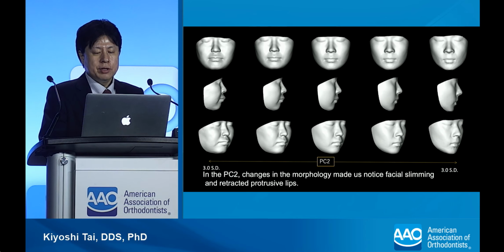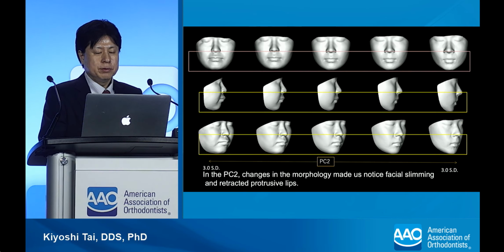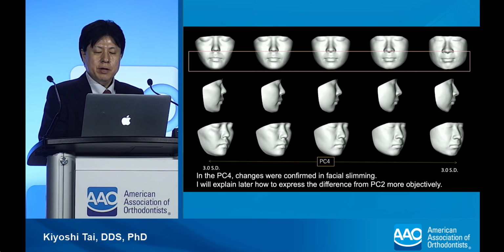In PC2, changes in the morphology made us notice facial slimming and retracted protrusive lips. In PC4, changes were confirmed in facial slimming. I will explain later how to express the difference from PC2 more objectively.